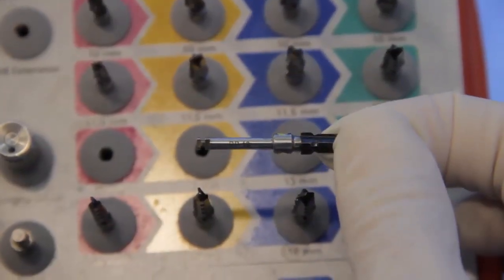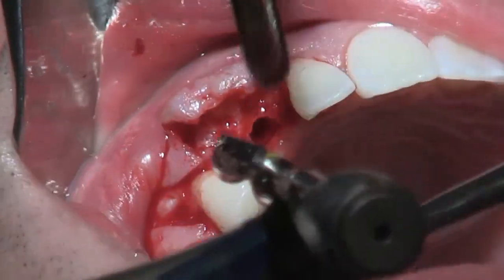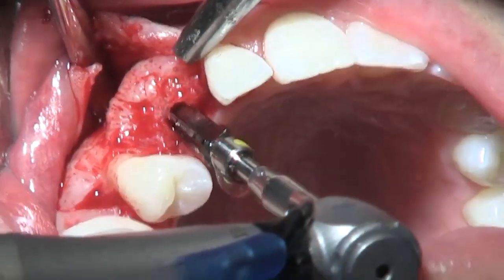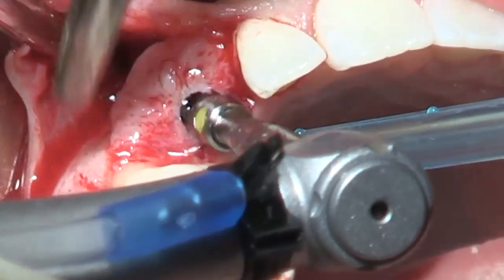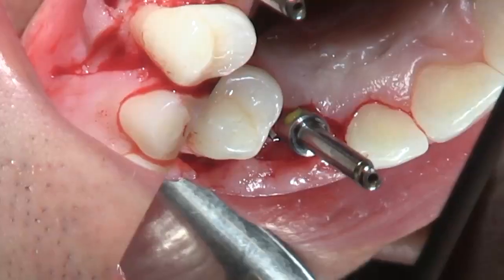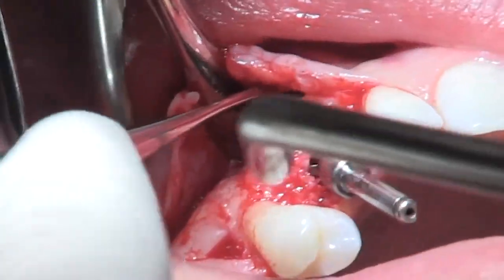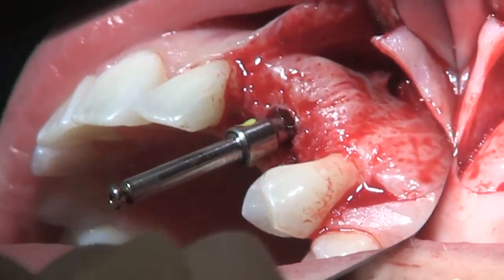The final drill is the regular platform 13 mm taper drill, again used with an extension. The osteotomy is now finalized with this drill to full length, and again taking note of the apical narrowness of bone and the perforation. Here, the check of the position with the surgical guide confirms the optimal mesiodistal buccolingual position, but as well the minor perforation at the apex, which is showcased in this view.